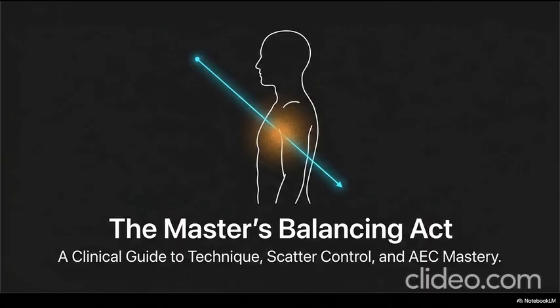By shrinking the field down to just the anatomy of interest, you drastically cut down the amount of scatter produced, which immediately improves the image contrast. And it lowers the dose. Yes. Simultaneously, you are drastically reducing the total volume of tissue being irradiated, which lowers the patient's overall radiation dose.